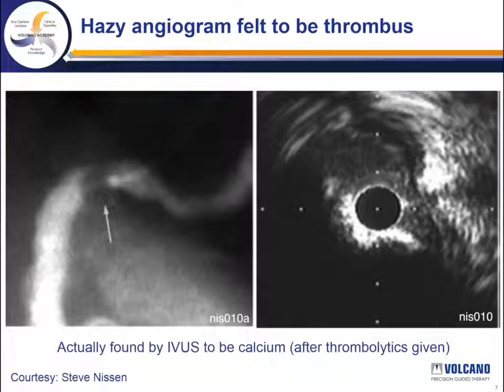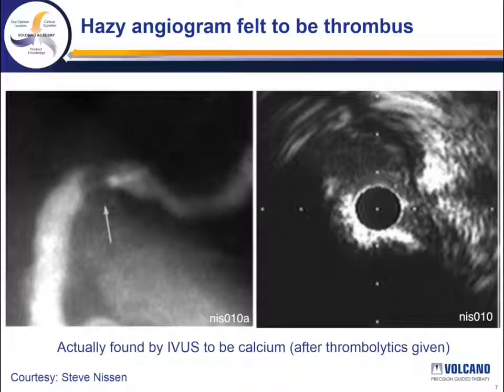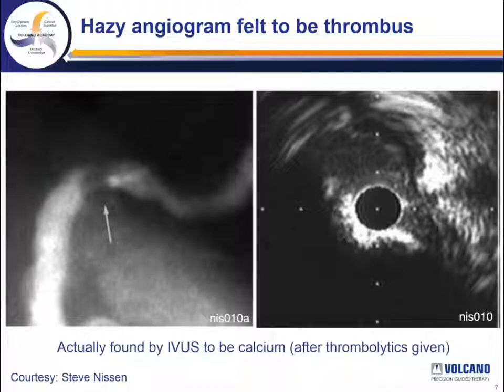This is a hazy angiogram of the proximal right coronary. It was actually felt to be thrombus and the patient was treated with thrombolytics and prolonged heparin infusions. When the lesion did not change over several days, intravascular ultrasound was finally performed and showed a very heavily calcified nodule with marked lumen distortion. The patient then went on to have rotational atherectomy and stenting, which would of course be the appropriate treatment.